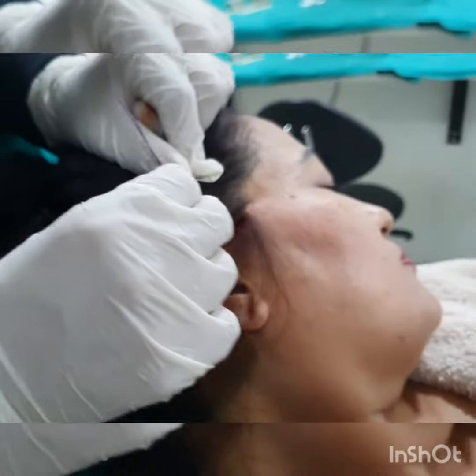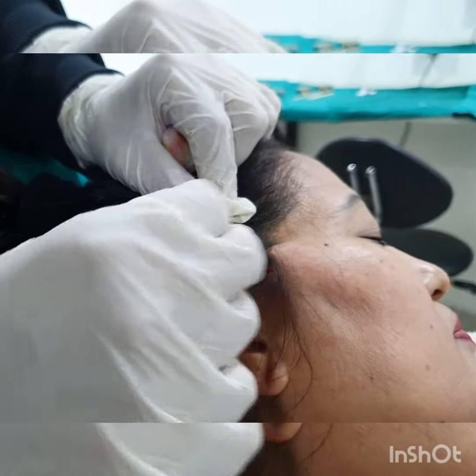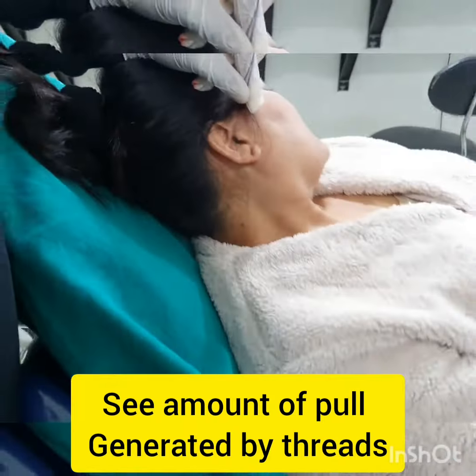Now you can see the amount of pull that we can generate, and the next step will be to tie the threads and fix the face in this position.